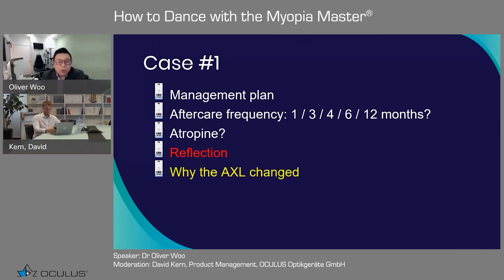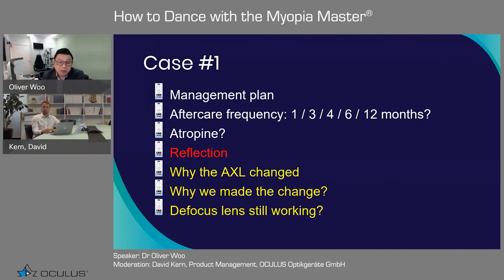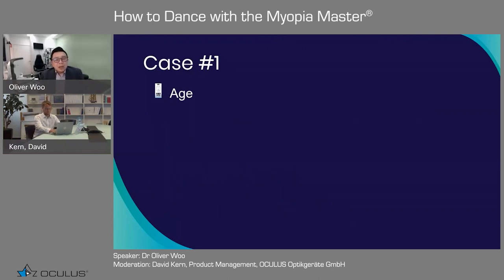Something for us to think about is why there's axial length change from July last year until April. Why did the axial length change? Is it because the defocus lens is not working? Or is it still working if we continue to wear the lenses? So why do we make these changes from defocus lenses to orthokeratology? There are a lot of things we have to think about when we manage myopia. It's not just switching quickly from one option to another. There are a lot of things we need to think about when we see a case like this.